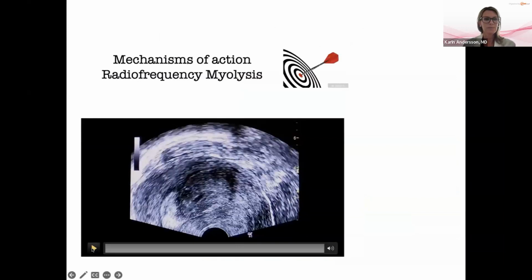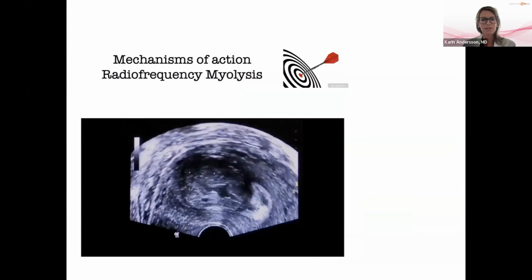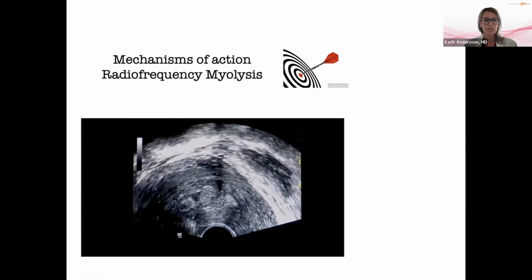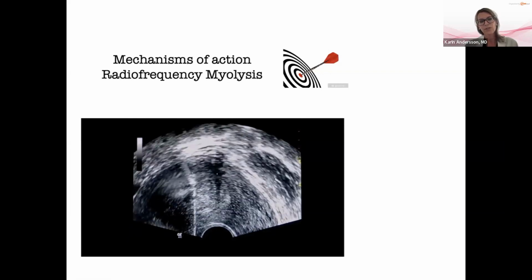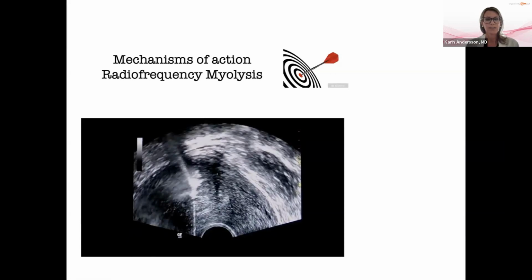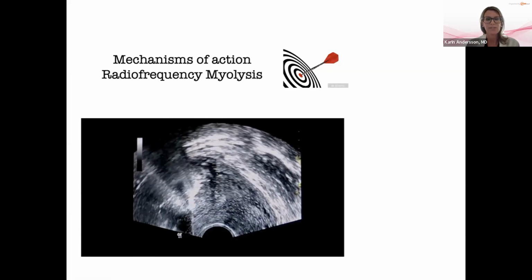You will see it even better here. We have speeded up this video a bit, but you can see the dimension of the fibroid. You can use the settings on your ultrasound. You can also put the virtual track, which makes it easier to find. Here you go in with the electrode to the farther distance of the myoma, where you start your procedure, letting the electricity, the radio frequency, move.